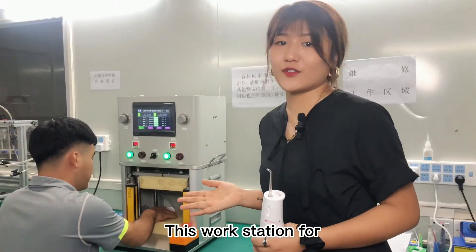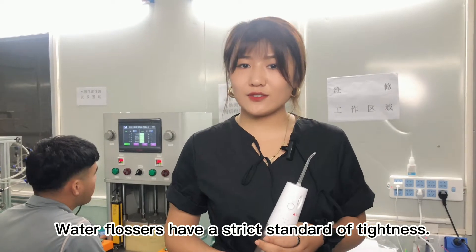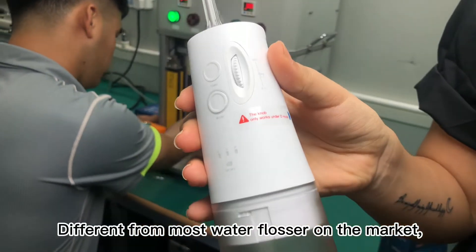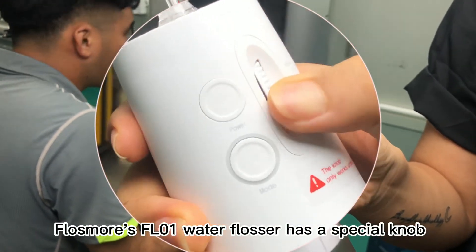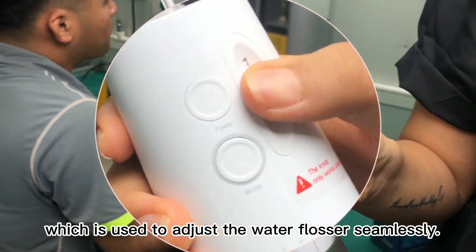This workstation is for the air tightness test. Water flossers have strict standards of tightness. Different from most water flossers on the market, Flosmo's FL01 water flosser has a special knob which is used to adjust the water flow seamlessly.